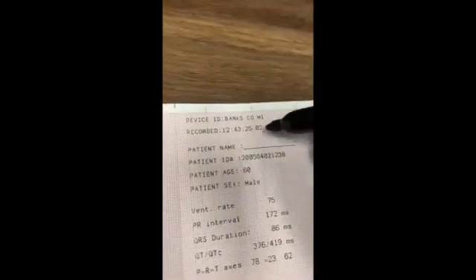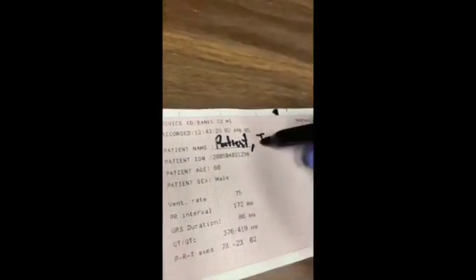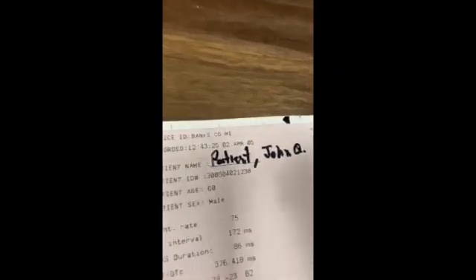Once a quality ECG prints, it is time to photograph the ECG record and send it to the doctor and APC. Follow these steps precisely. 1. Tear the 2 or 3 interpretation patient data pages off of the printout and position them above the lead tracing pages on a clean, flat surface.